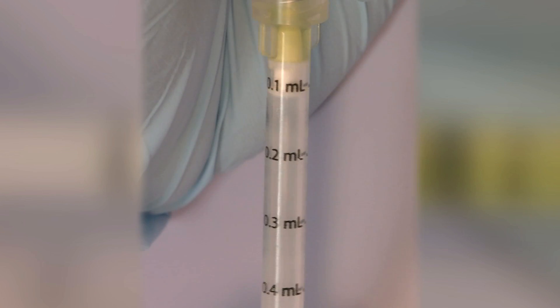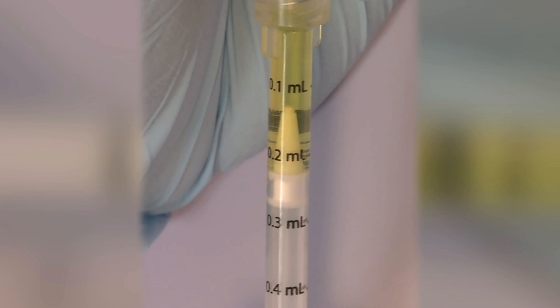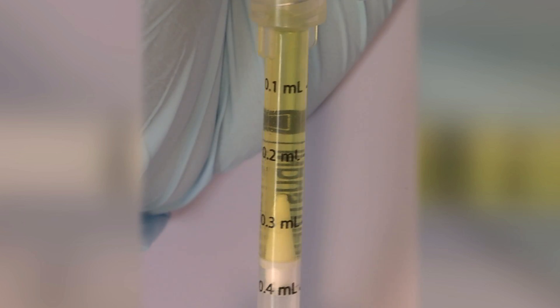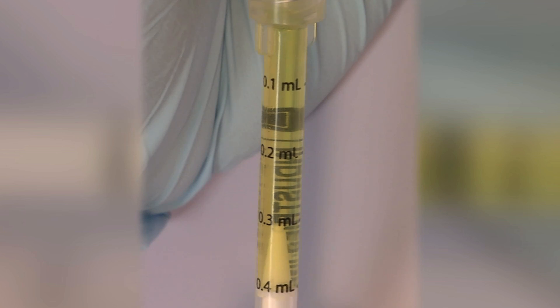With the bottle inverted, slowly draw into the syringe the amount of Cetacane liquid needed for the area to be treated, using the graduated markings as a guide and not to exceed the MRD, which is a full syringe.